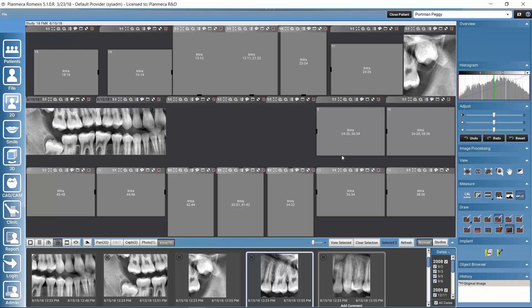Let's not finish building this study since we already understand the concept. Instead, let's move on to the admin module where we can see how to build custom templates. If those standard templates already in Romexis don't serve your needs, you may build your own ones in the admin module.